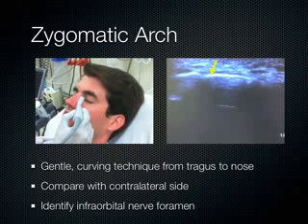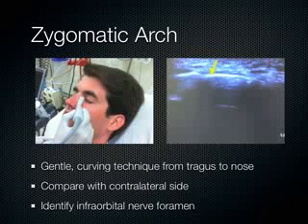So just keep in mind that for the zygomatic arch and looking at the maxilla, you want to start at the tragus with the indicator towards the patient's scalp, and on the screen that indicator is on the left side of the monitor. Therefore, the left side of the screen indicates the superior aspect of the zygoma, while the right side of the screen indicates the inferior aspect of the zygoma. That corresponds to this lower part of the transducer, the indicator being on this part of the transducer towards the apex of the skull.